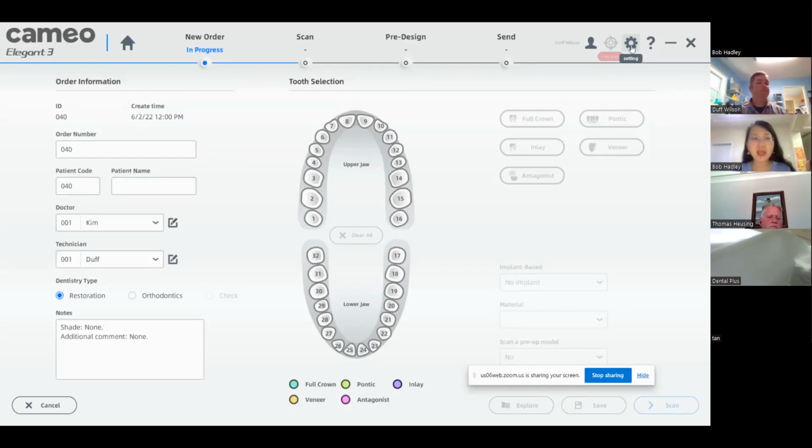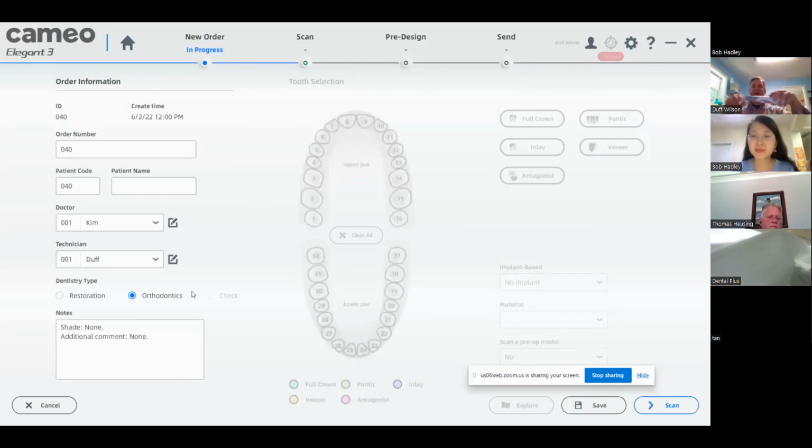Okay. And Tan asked another question. He asked, can the tip be reversible, and can it scan the upper palate? I hope I pronounce it right. So Tan asked, is the tip reversible and can it scan the upper palate? Yeah, so it's not reversible. It has an angle to it, so it can only go on one way.